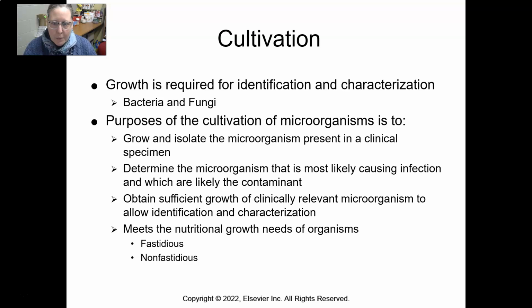So the purposes of cultivating or growing the bacteria or fungi on plates or on some media is to isolate the microorganism that is present in a clinical specimen so we can identify it so we can better treat the infection. Within the growth that will happen on the plate, we also need to be able to determine which of these is likely the culprit for the infection and which of these might be innocent bystanders such as part of the normal microbiota.